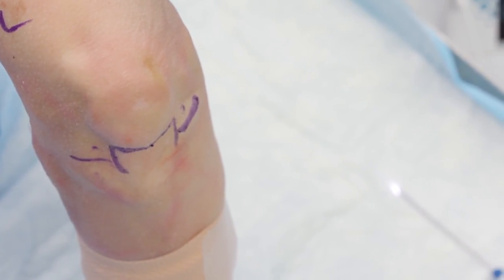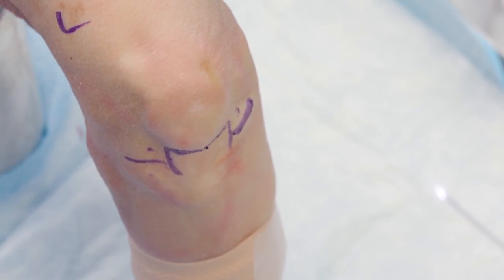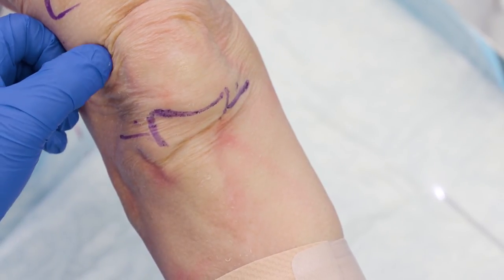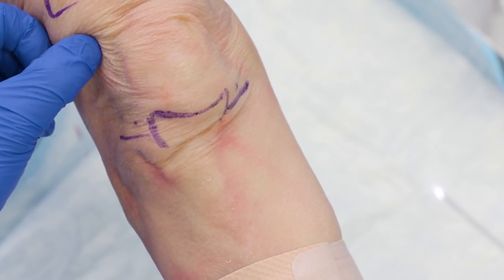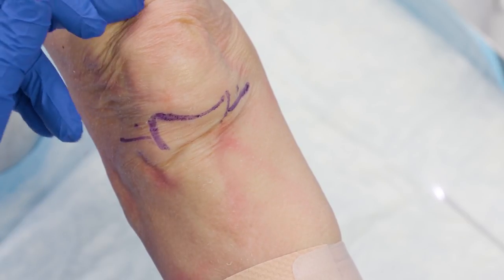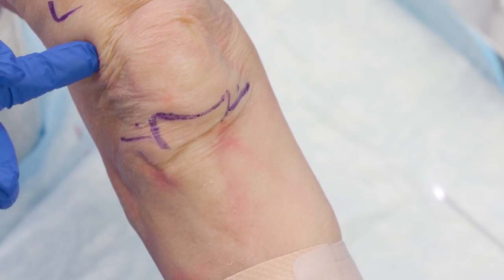To get more anesthetic into the knee joint, I'll extend the leg and go suprapatellar on the lateral side. I'll inject the skin wheal there as well in case I need to use that port, then inject the remaining five to six cc's of one percent lidocaine into the joint through the suprapatellar portal.